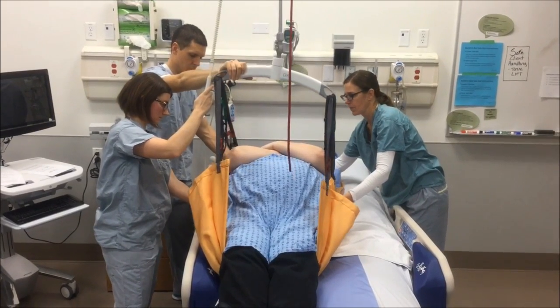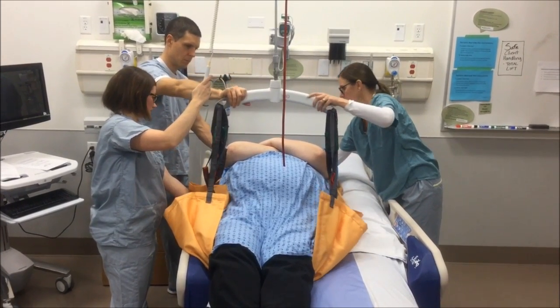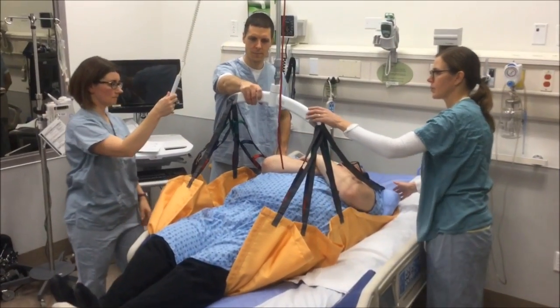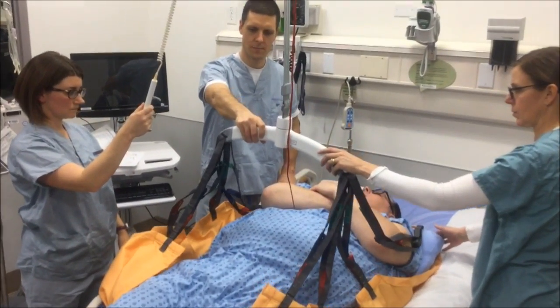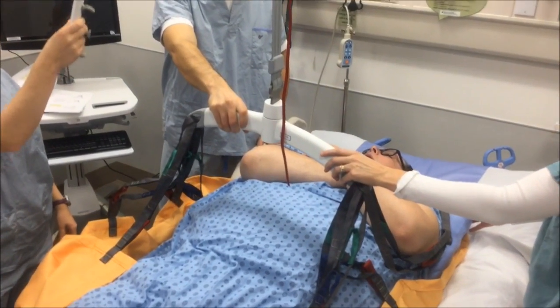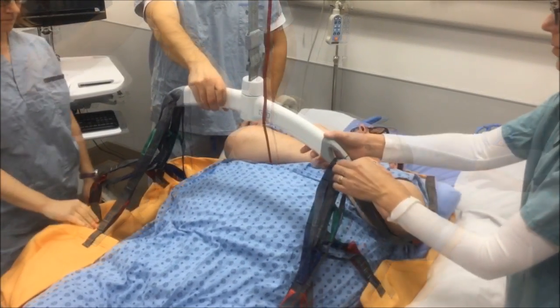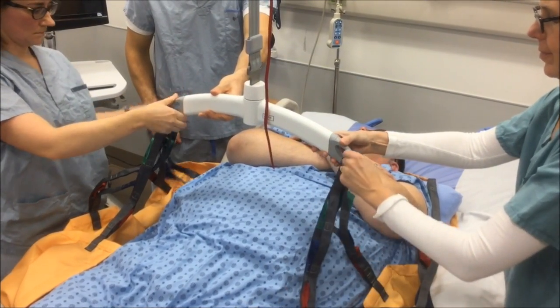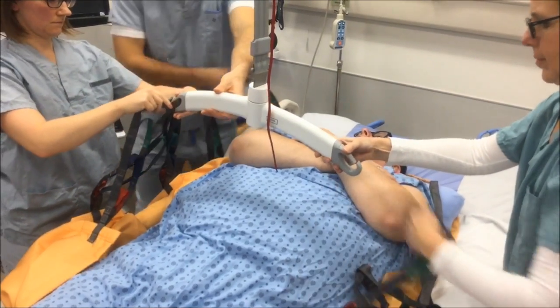Reposition the client as needed, whether it is upward on the bed or, in the case of this video, to one side of the bed, to ensure that there is enough room to log roll. One worker operates the lift while one or more workers guide the client. Lower the client onto the bed. Once on the bed, detach the sling from the spreader bar. The lift remains in position.